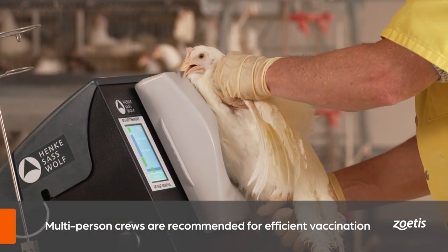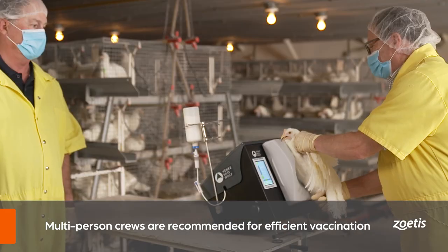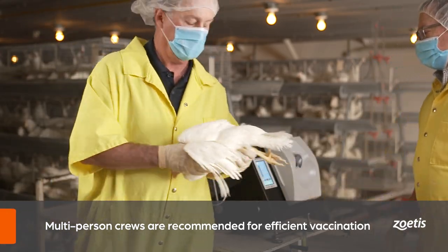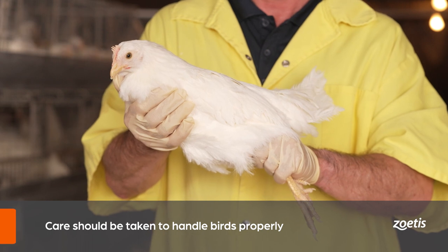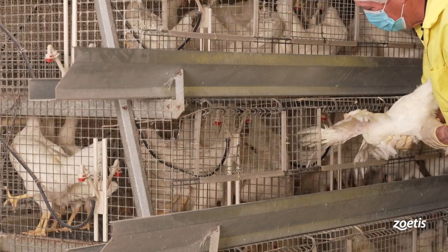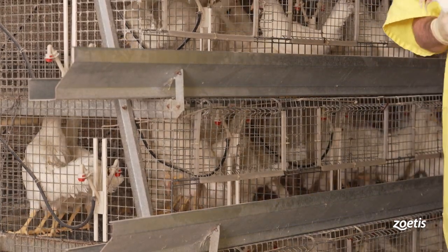Part two: operating the double breast vaccinator. With the device turned on, vaccine setup complete, and settings adjusted, the double breast vaccinator is ready for use. For most efficient results, two-person crews are recommended — one to serve as the operator and one as the bird collector. Remember to always handle birds appropriately using techniques that are in accordance with good animal welfare practices. The bird collector will remove the bird to be vaccinated from its housing.